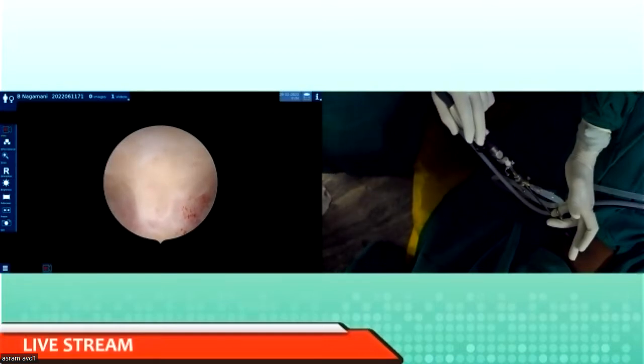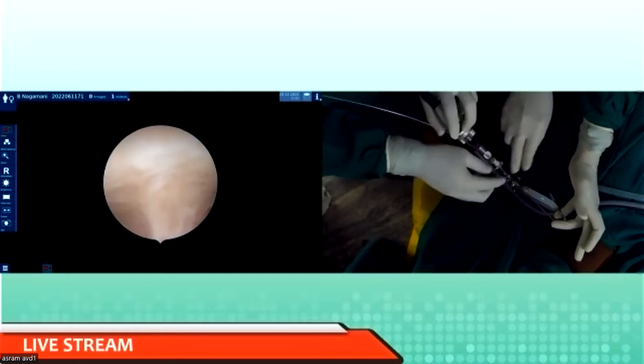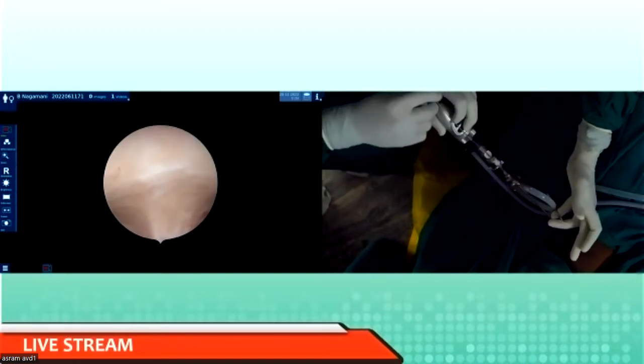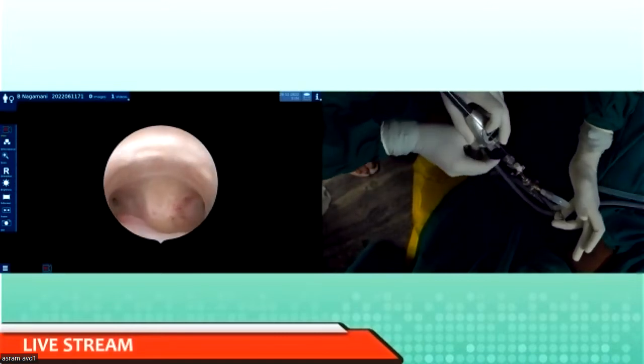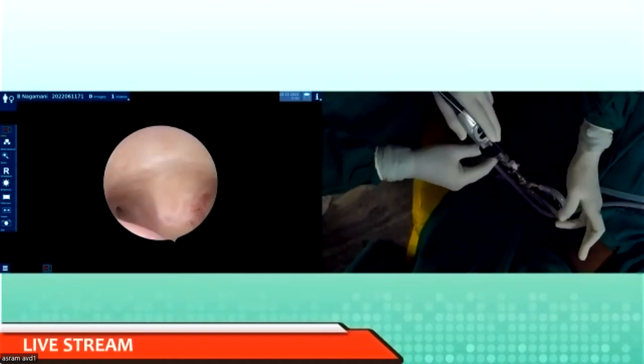So did you realize why he thought it was a septum? He told in the last class that when we were seeing both the ostia simultaneously, they should be at the same level. Now you see that when you see both ostia, can you see there is something like two caves? Sir, I can see. Understood? Yes.